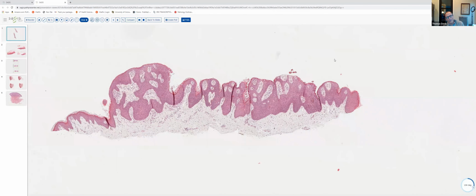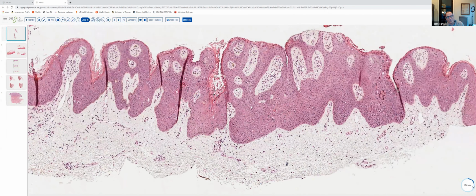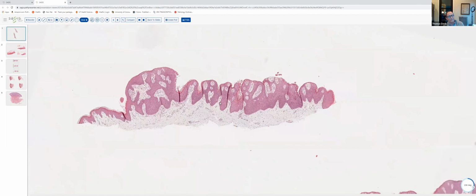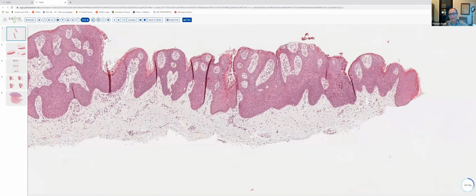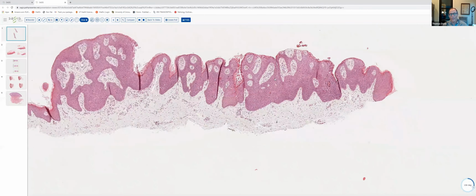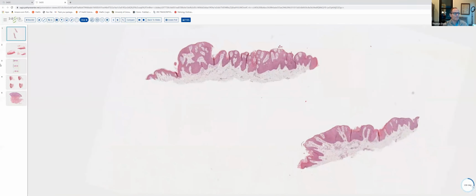Of course, typical condyloma will not have atypical keratinocytes and evidence of disordered maturation. And the degree of atypia in Bowenoid papulosis, this is real full thickness atypia, can vary from a lesion like this to just a few scattered atypical cells present throughout the epidermis, depending upon the age of the lesion. So first case, condyloma acuminatum.